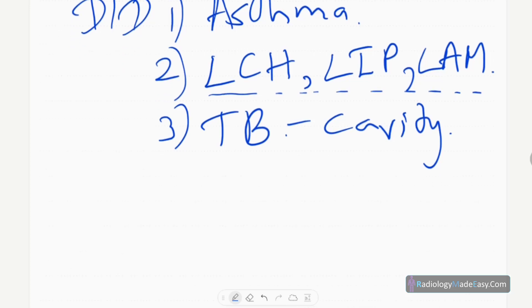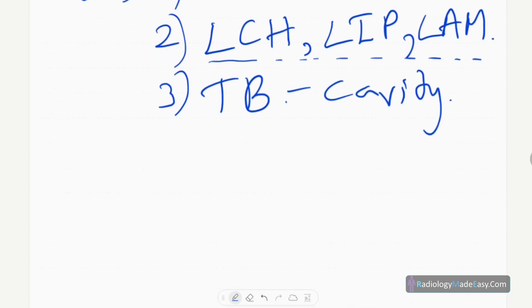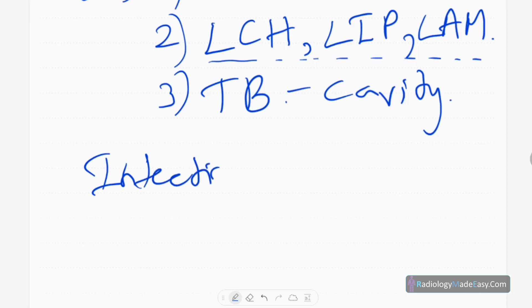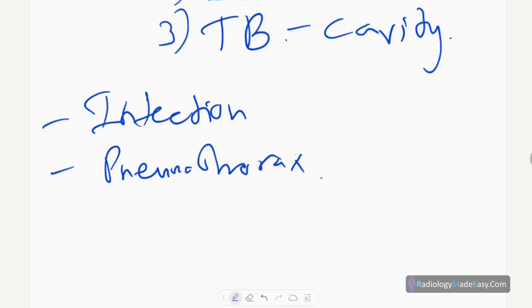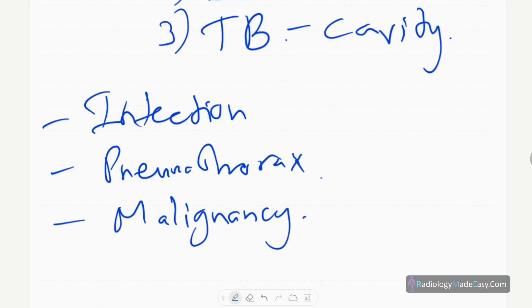COPD usually occurs in smokers, and can also occur in cystic fibrosis and alpha-1 antitrypsin deficiency — those are the main etiological factors. The complicating features to look for on a chest X-ray in COPD are: infections, pneumothorax, and malignancy. You have to look for these three complicating features when reviewing a chest X-ray in a COPD patient.